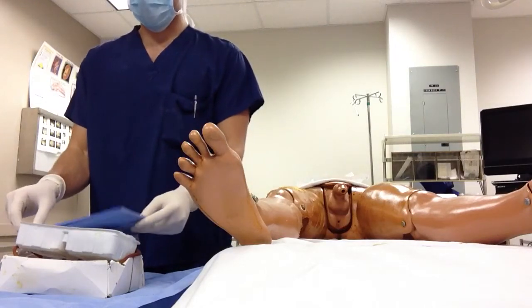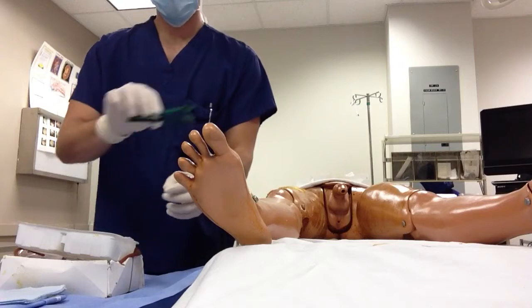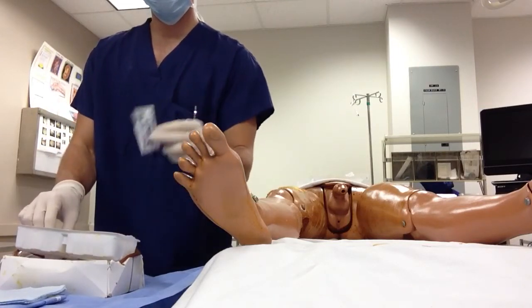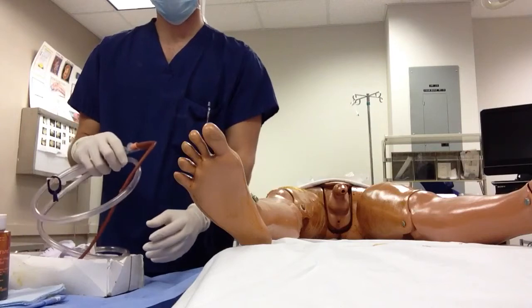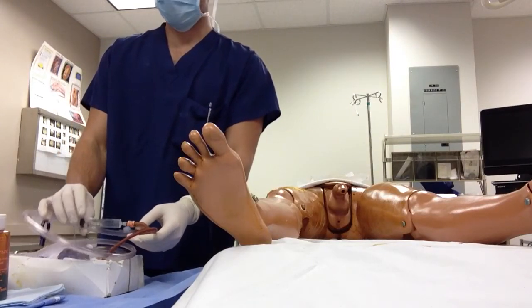go through your cath kit and make sure your supplies are there. Make sure you have a towel, tongs, some cotton balls, lube, your solution, and your cath kit which contains a syringe.